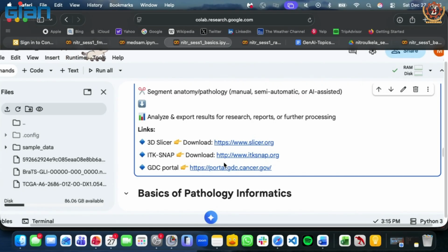So these are all imaging modalities, right? And if you are diagnosed with some sort of cancer, it's not just the imaging data; it's the histopathology data. You also have the genomic data, etc. So all the different visualizations are different. For example, this is all for radiology images. You can use something called QuPath or OpenSlide for histopathology image visualization. There is a very good open source, I would not say library, but an analysis platform called Xena. I can discuss. Oh, it's here.